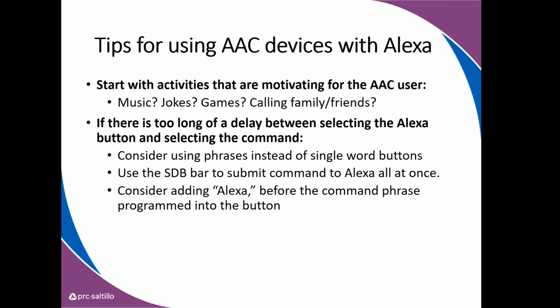For some kids, I've even put Alexa, I don't use a separate Alexa button. I put Alexa, tell me the story, all in one button. So the button might say, tell me a story, but the voice message that's spoken includes Alexa in it. So you don't have to put Alexa text on every button, if that makes sense, but you can include that in what the button says without seeing it, so you can still control her. So those are some things that are helpful.